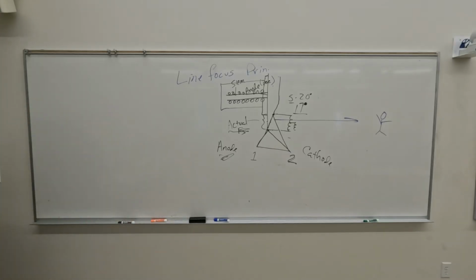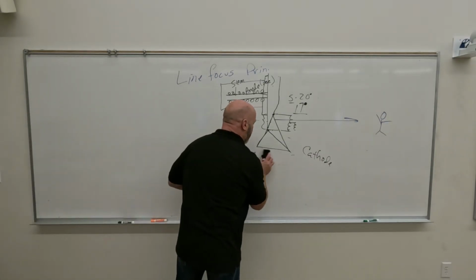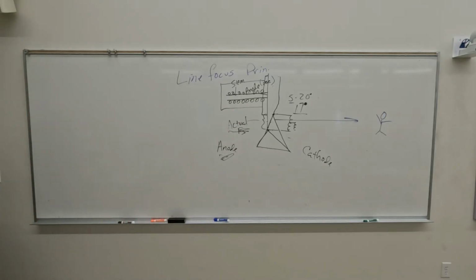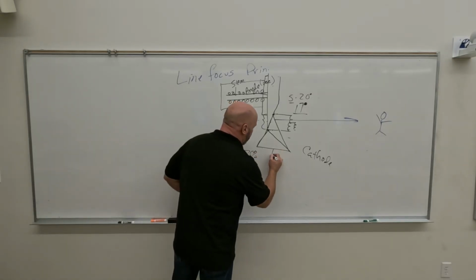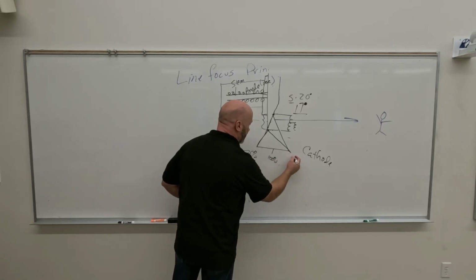So, anode heel effect. Here's the other thing about it. Let me give numbers that are a little more representative of what Bushong has drawn here. He says on the anode end we may have as little as 75%. The center is 100% of what you want, and the cathode end, what does he say?